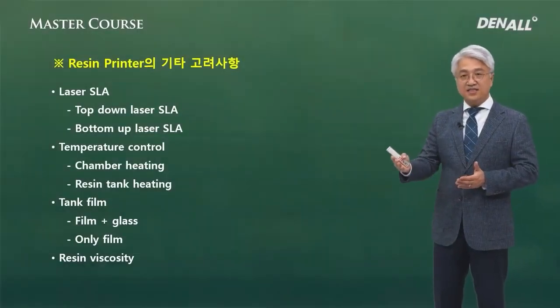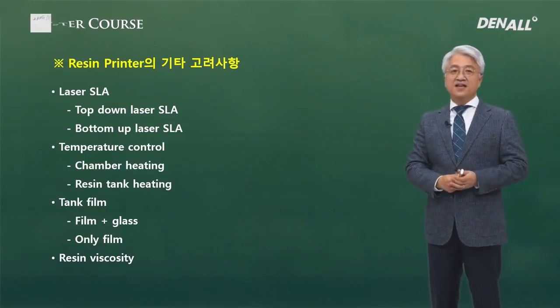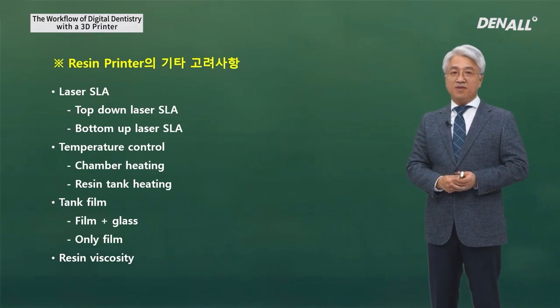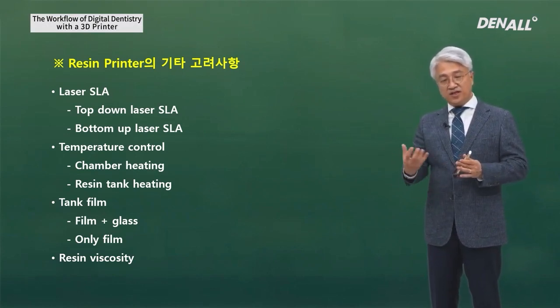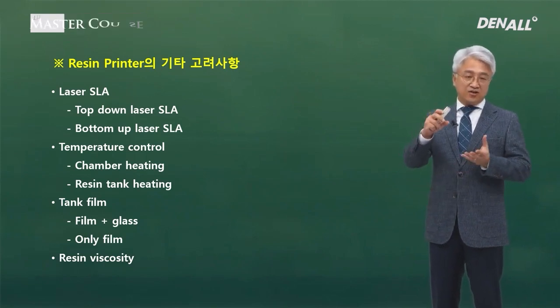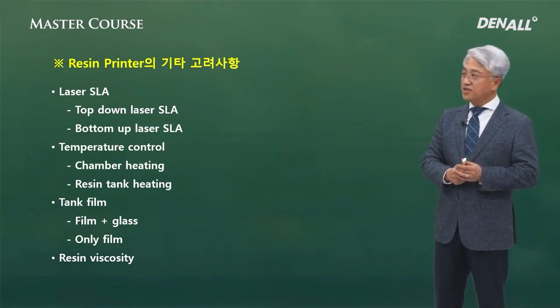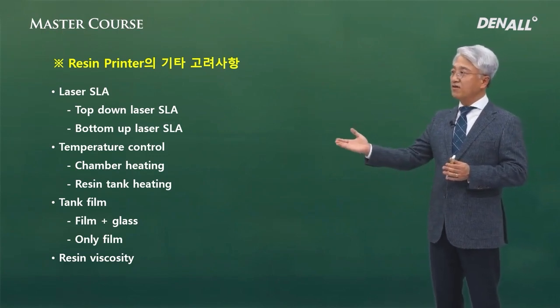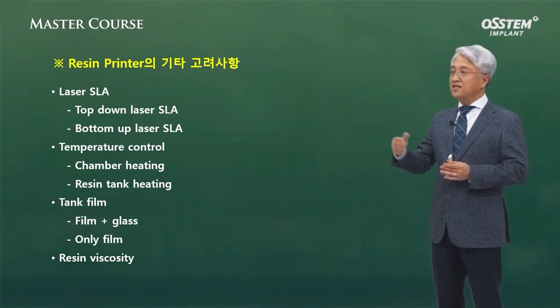The 3D printers that we use require flowable resin. Resin is used for the additive process. This is most fit for the restorations. There are multiple considerations that we need to take in. You can do printing top-down or bottom-up. There are differences in characteristics.